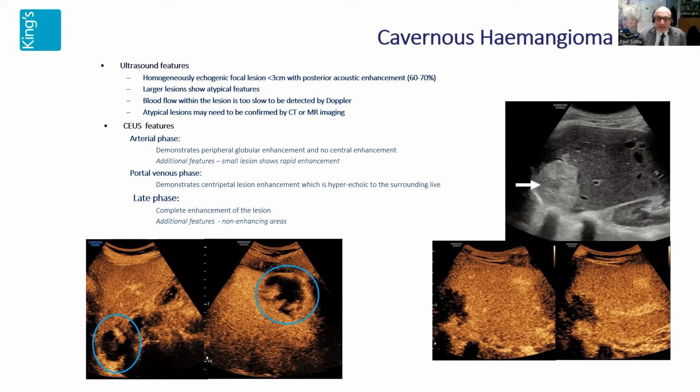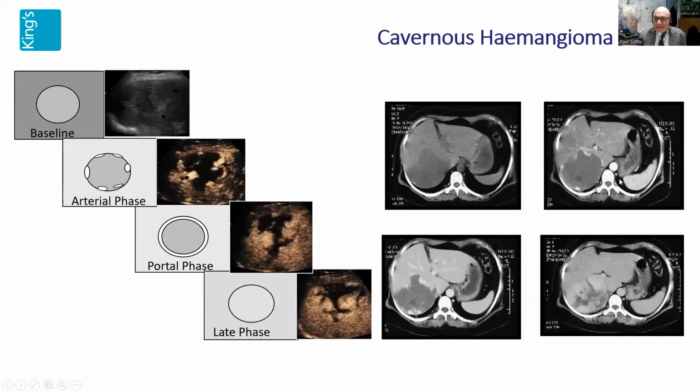as you're watching it in real time with no danger or detriment to the patient's health, and you can watch that disappear completely. Contrast that with a CT examination where snapshots in time are produced, and of course, each time you're producing a CT examination at a different phase of contrast enhancement, you're subjecting that patient to radiation. In ultrasound, you get the same information in real time over 3 or 4 minutes with minimal discomfort or increased morbidity to the patient. It's not just radiation. The contrast burden from iodinated contrast and renal impairment is something to bear in mind.